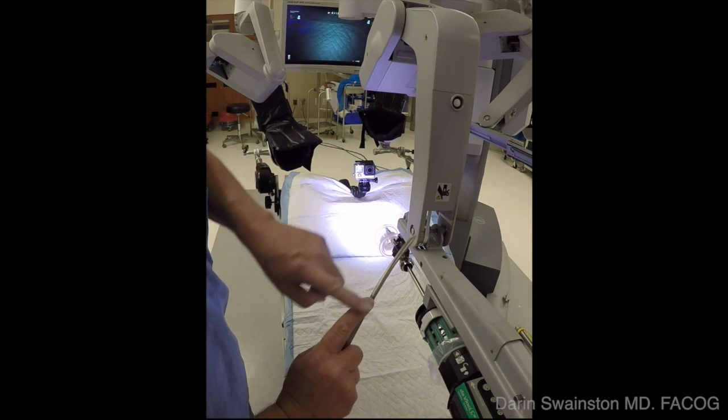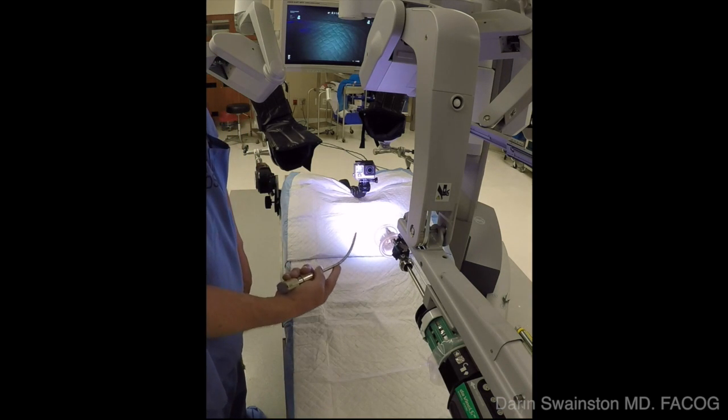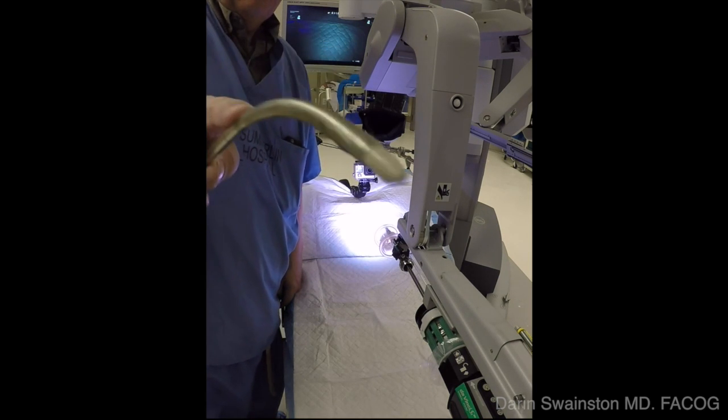To reduce the amount of time it takes to dock and position the trocars in the abdomen after placing the single-site camera, this technique has been shown. It's an abbreviated technique.